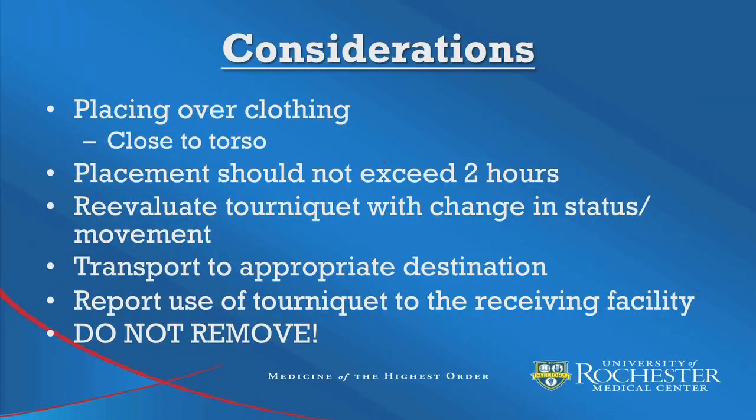There are some things we need to consider when using a tourniquet. 1. When in an environment that requires rapid placement of a tourniquet, it is okay to place the tourniquet over top clothing. When placement of the tourniquet is over top clothing, placement should be as close to the torso as possible. 2. Placement of the tourniquet should not exceed 2 hours.